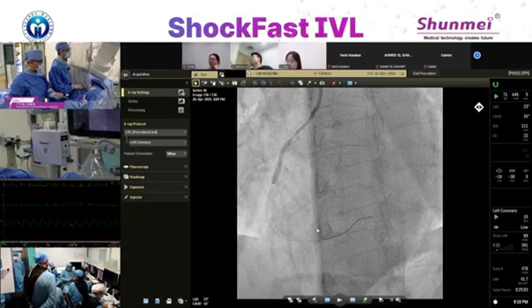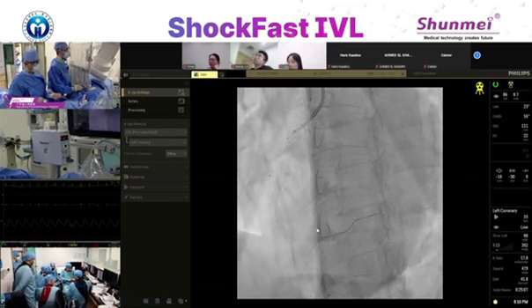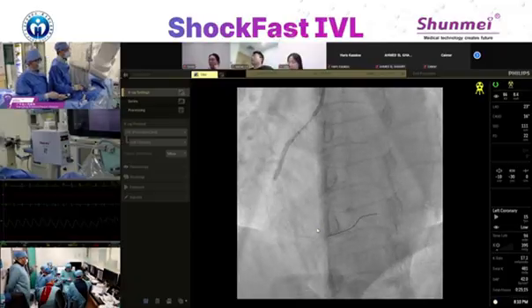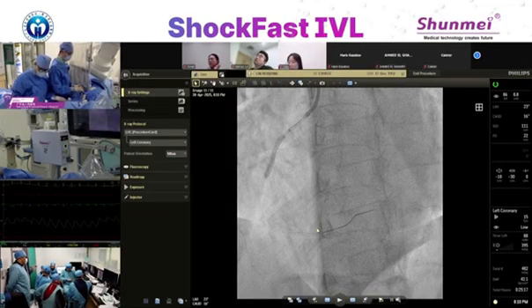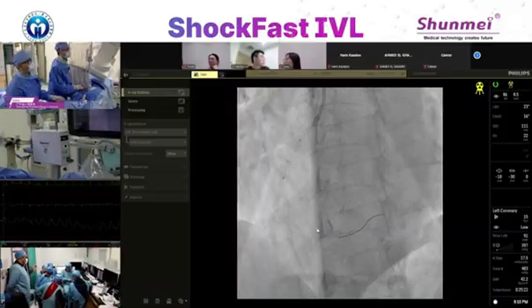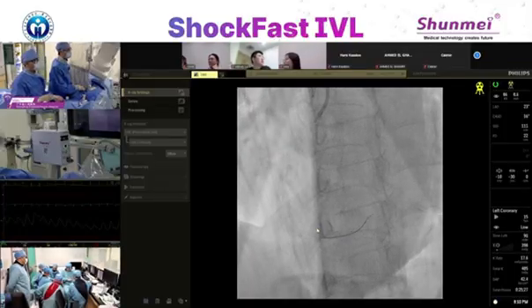Okay, I recorded it. 3.0 high pressure. 10. 12. Down. Record. I need to handle the Godzilla.